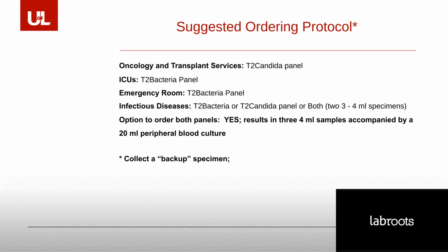So a physician can order both, but in our suggested ordering protocol, which we have shared with them, this is where we see the highest return on our testing, given the type of patient population. And it supports the concept of diagnostic stewardship very well. So that backup specimen we find is very, very helpful. It's rare that we have to use it, but we have it there in the event that we have a problem.